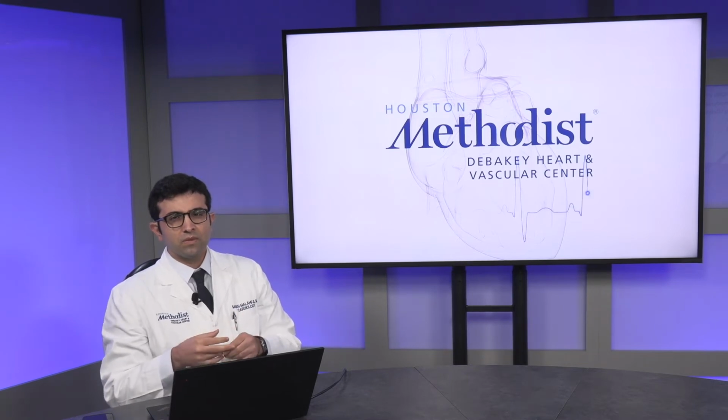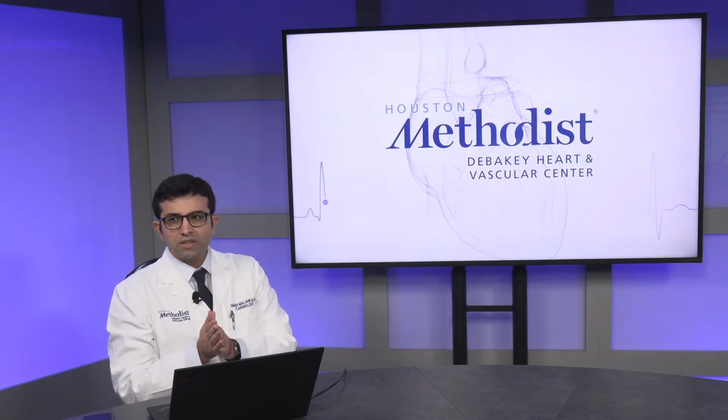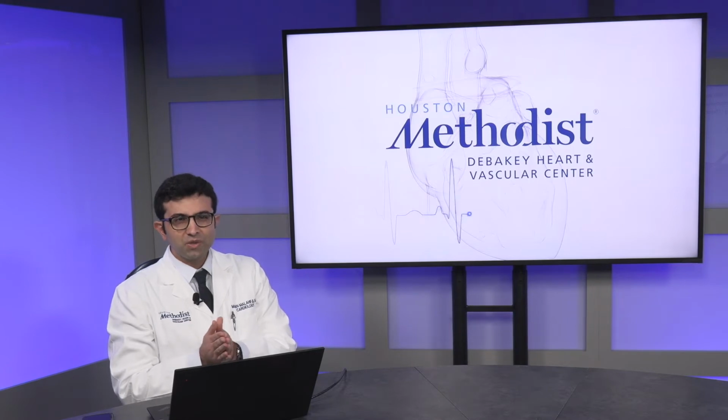Yeah. And the other thing is MRI technology is also improving. You have real 3D MRI currently, right? Yes, absolutely. It takes forever, but that's okay. It will never be a one breath hold. I will show some data, but yes, it's still a work in progress.